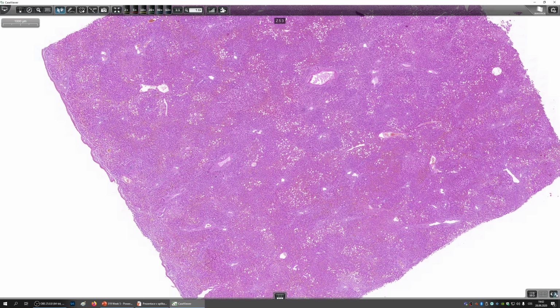But now to thrombosis. So thrombus develops if this is a pathologic process. Well, you should be familiar with the Virchow's triad, which is basically the triad of factors which can lead to thrombosis. And these three components are injury to the endothelium, change in blood flow, and change in the coagulative capacities of the blood. You can read about this a lot in theory, so I suggest you to do so. Now we will be discussing mostly morphology. So let's move on to the next slide.